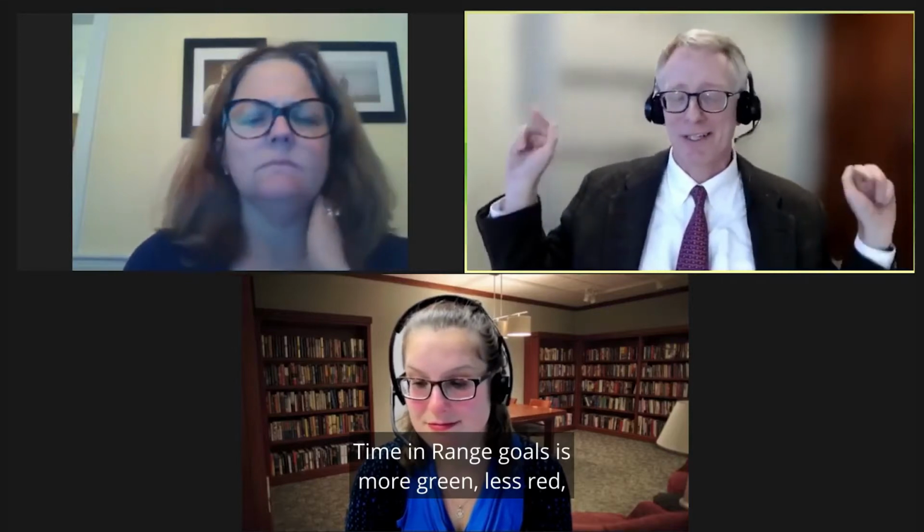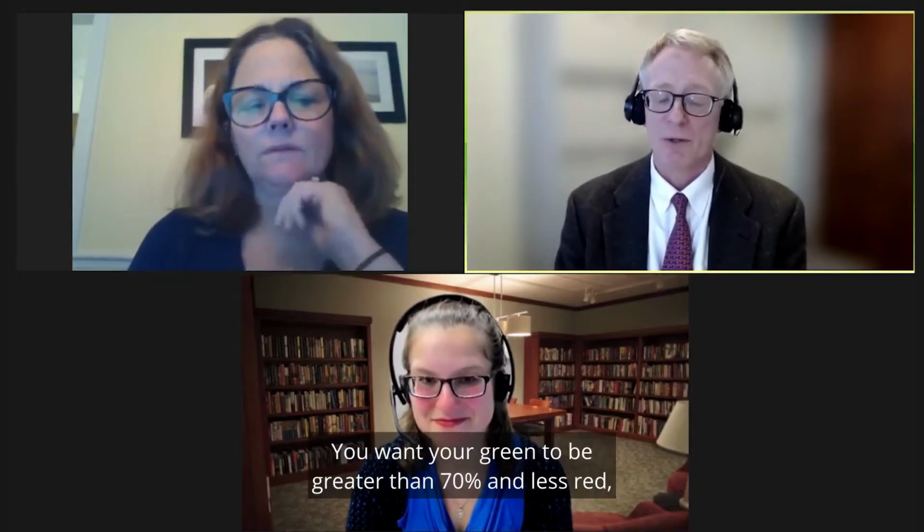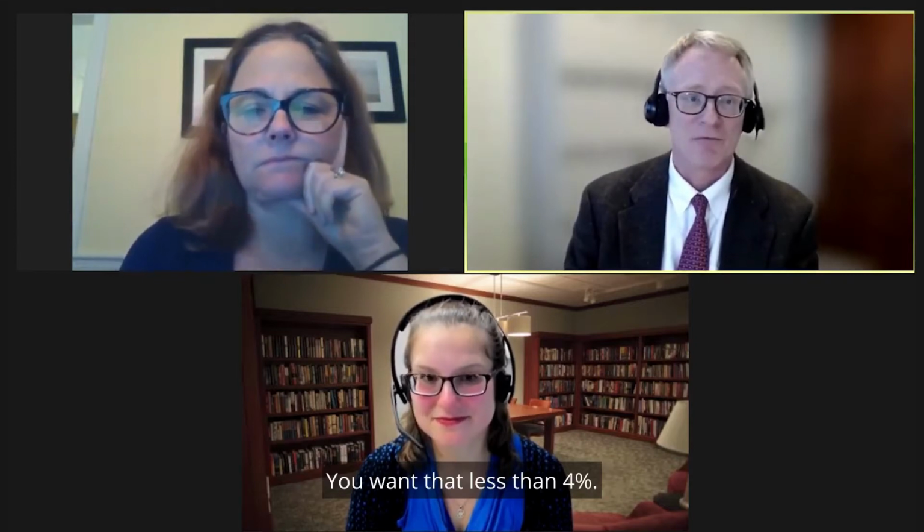Wonderful. So here's a question. This is a practical question. A very useful mnemonic in helping to think about time in range goals is more green, less red, which is to say, if you're looking at that stacked bar graph, you want your green to be greater than 70%, and less red, which is the hypoglycemia range. You want that less than 4%.